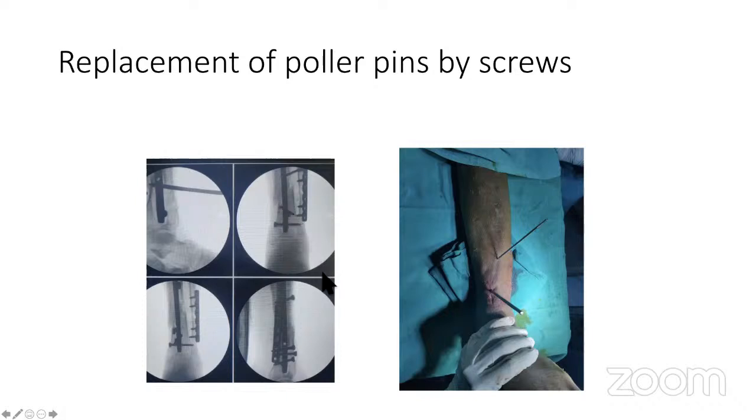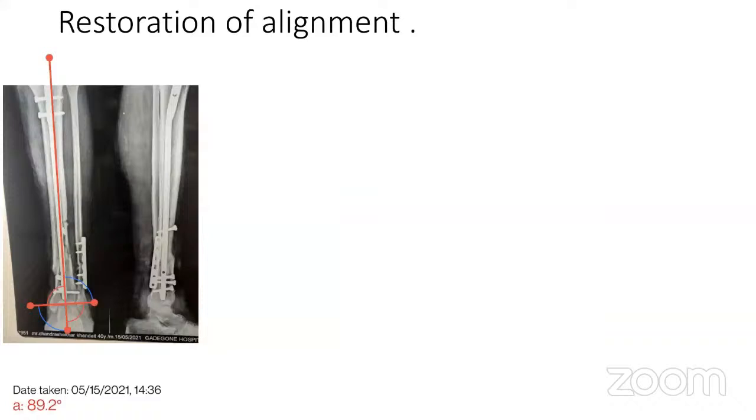And at the nail junction distally, I put about 3 or 4 screws, I think. And this is how, by closed reduction technique, without opening the fracture, I tried to do it. This is the nailing, and you can see here the post-operative X-ray. And this is the fracture; I have an easy X-ray, and it has perfectly healed up.